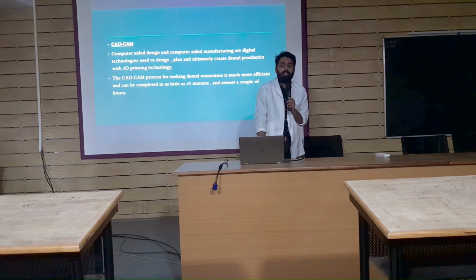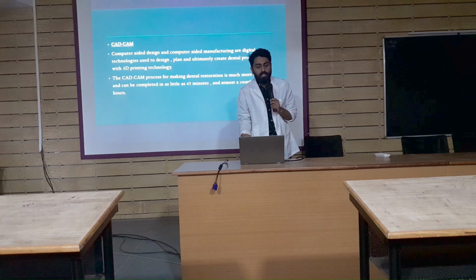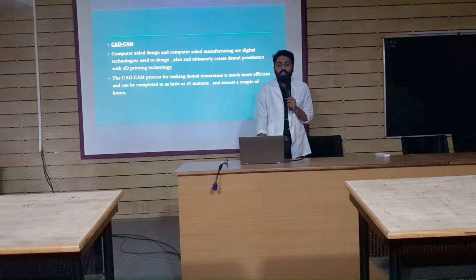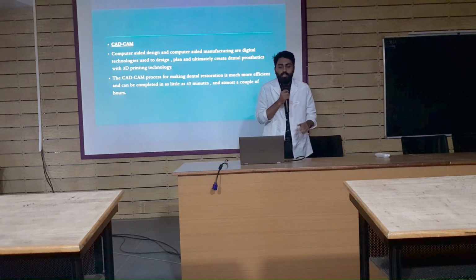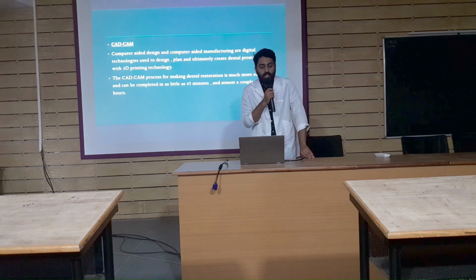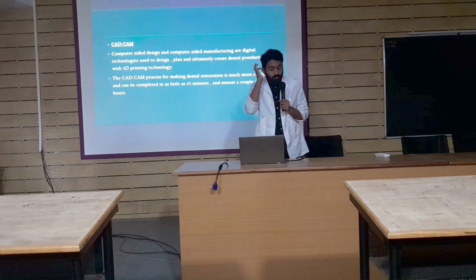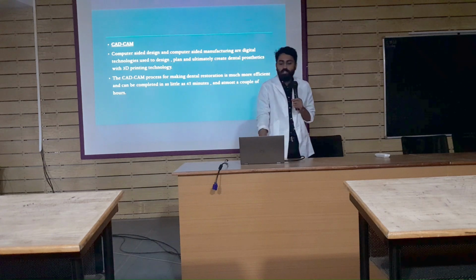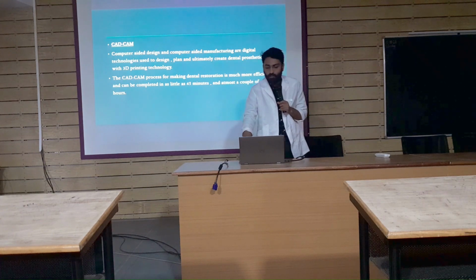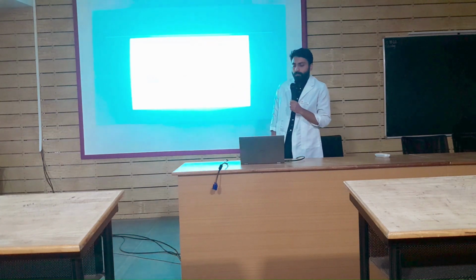Next we come to CAD/CAM. CAD/CAM is also very common these days. It's computer-aided design and computer-aided manufacturing, digital technologies that are used to design, plan and ultimately create dental prosthetics with 3D printing technology. So it has made the manufacturing process very fast. It can take as little as 45 minutes. So we have a video of CAD/CAM.